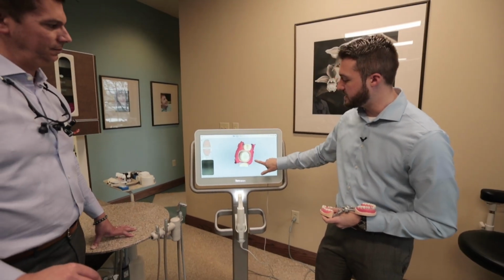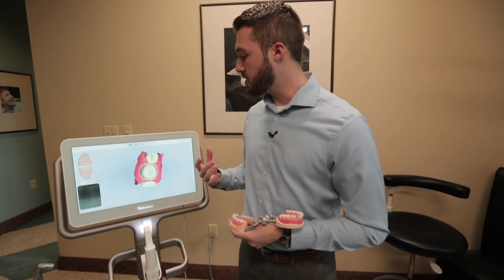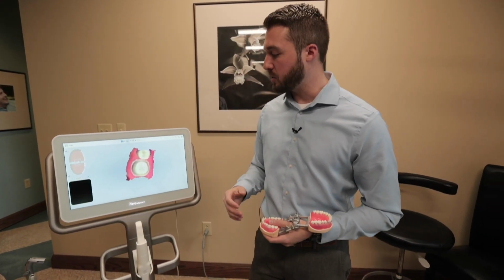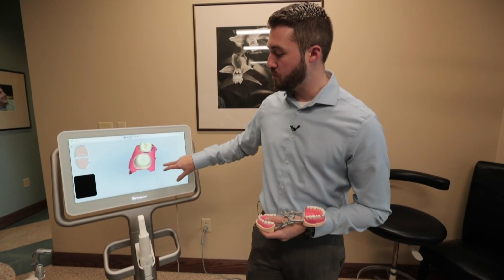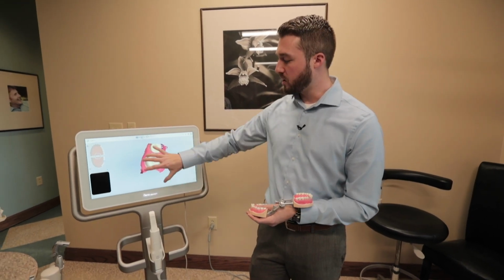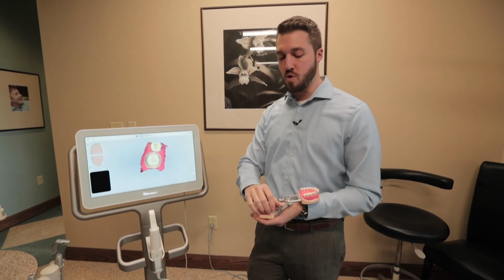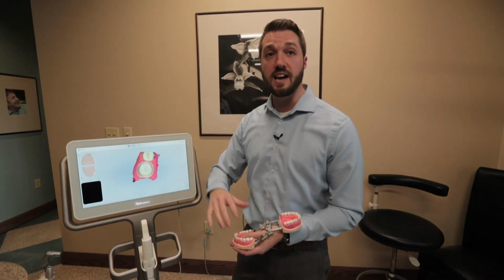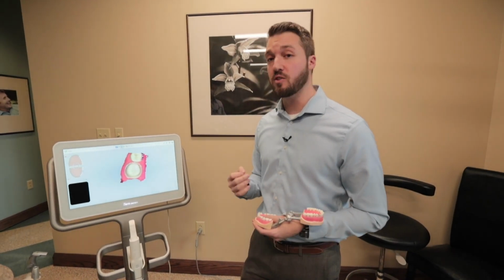The reason we do that is as we're packing cord or whatever retraction method we're doing, we wanna make sure that the tissue is retracted but also dry, okay? So what this allows us to do is capture that real quick and move on. As we keep scanning, we're gonna take this section, save it for later, and after we're done scanning, we're gonna remove that section and throw this beautiful scan in there, all right? That allows us to make sure we have very highly accurate scans.